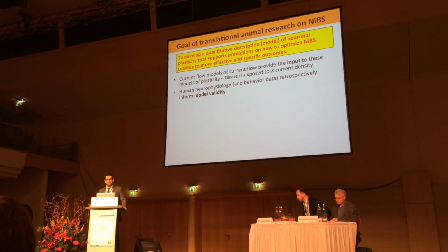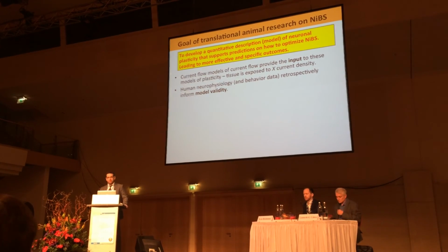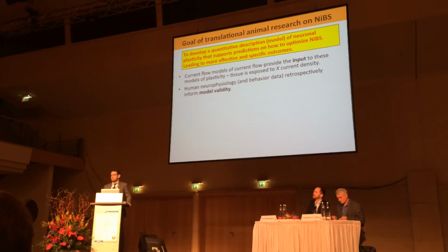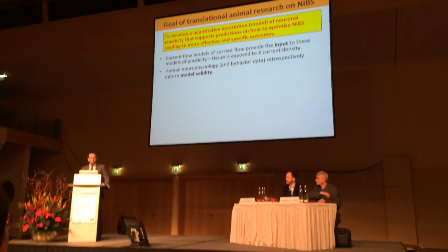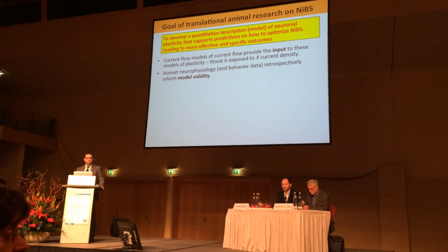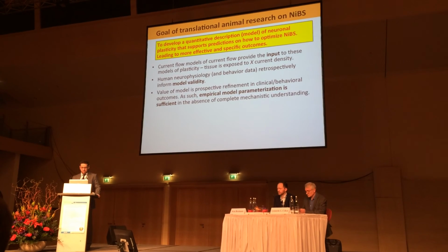But I think one theme that's really emerging is that the parameter space is huge. 11 hertz, 11.1 hertz, 11.1 hertz with 50% duty cycle. It's almost intractable, especially once you start talking about the fact that the behavior itself will affect what it does. And so for this reason, animal models may be able to facilitate this process.